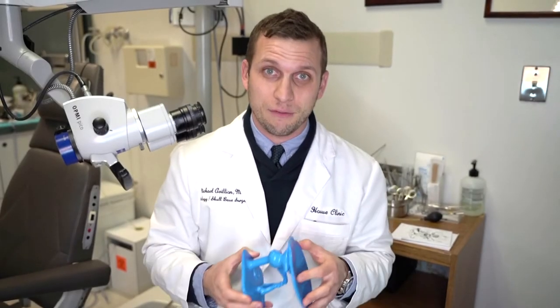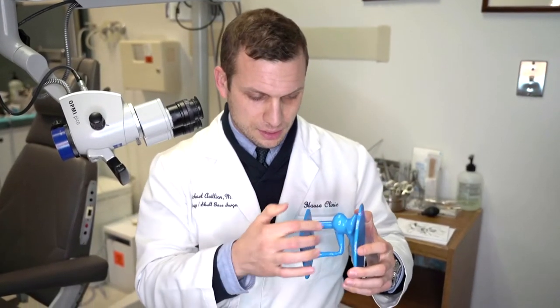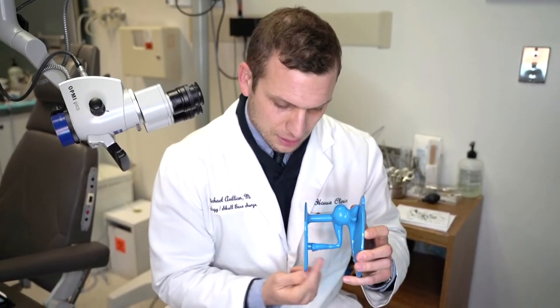So what is a stapedectomy surgery? Let's go over a few diagrams. Here's a model of the ear bones. Here we have the eardrum, this is the malleus here, the incus, and the stapes.